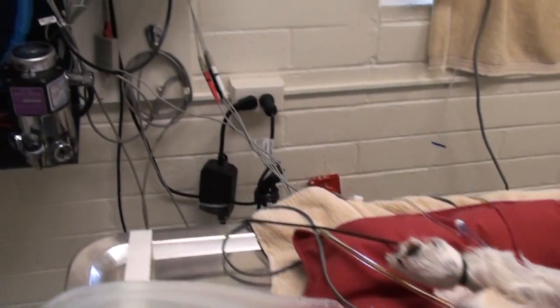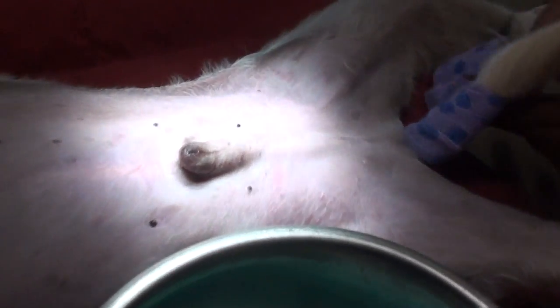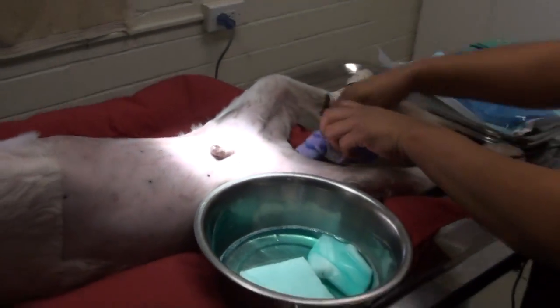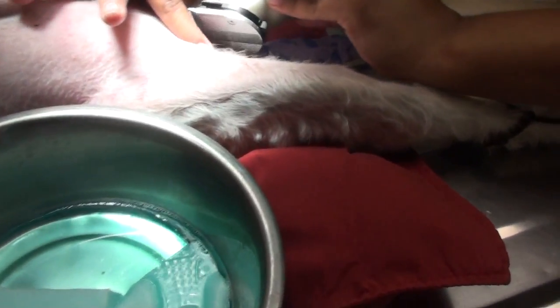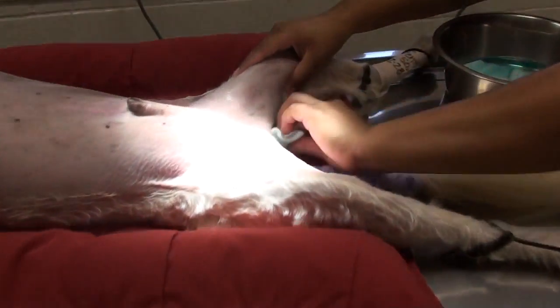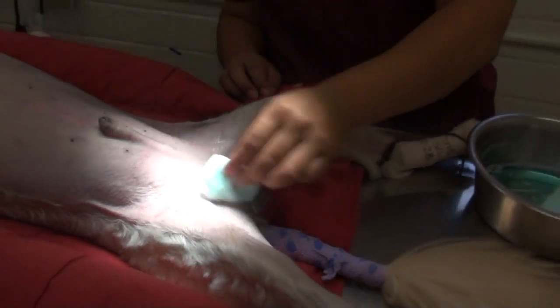Bogey's now laying down on the table, his vitals are normal, and we're prepping him up. We've shaved the whole area where we're going to do the surgery, as well as wrapped up the tail so it doesn't get in the way of the incision. We're prepping up the area of incision, which will be right over the penis. We make sure the whole shaved area is clean so there's no hair in the incision. We swab from around the incision outward to make sure all the bacteria are killed, because we don't want bacteria from the skin getting in.